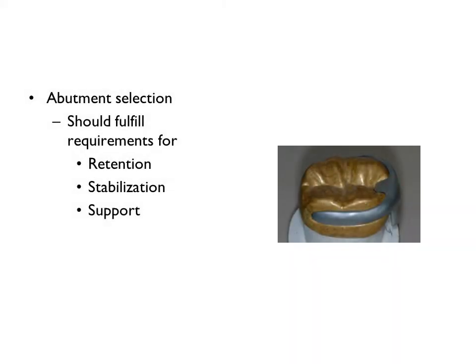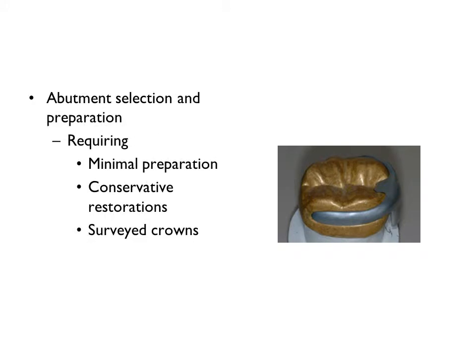Preparation of abutment teeth. After surgery, periodontal treatment, and any endodontic treatment of the involved arch, the abutment teeth may be prepared to provide support, stabilization, bracing, and retention for the partial denture. Abutment preparations fall into one of the following categories.